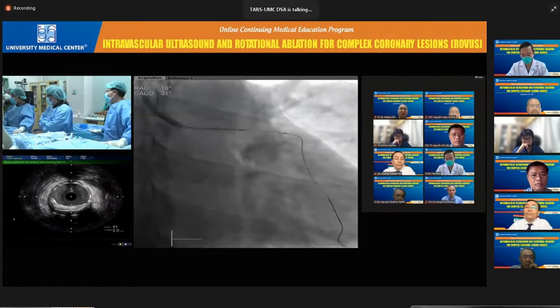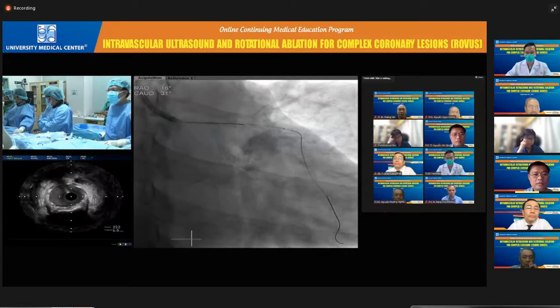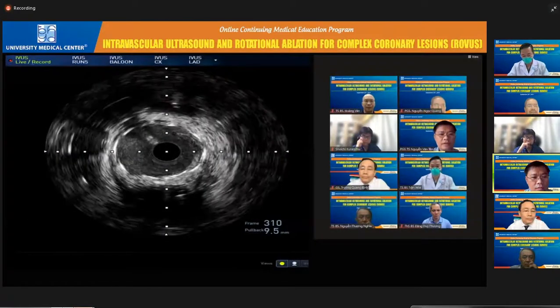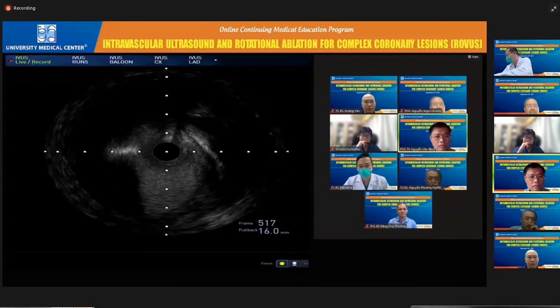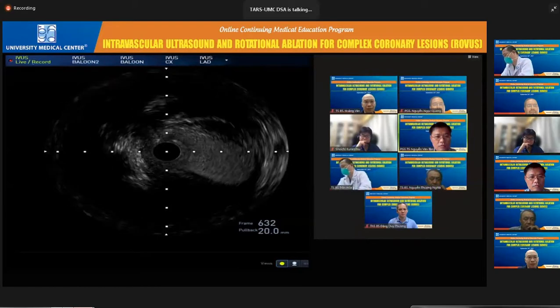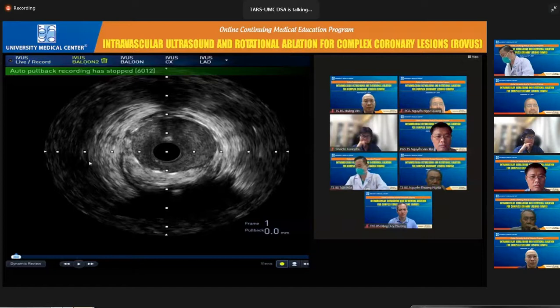Okay, I will do the. Can you see the IVUS? Yes. Yes. Okay, stop. Okay, I do the manual.